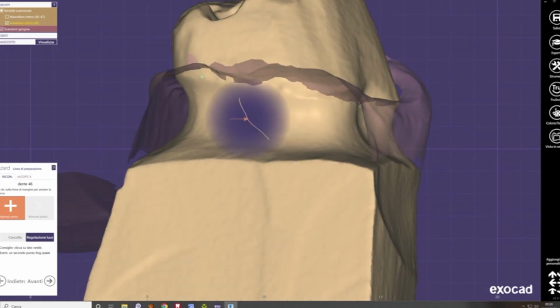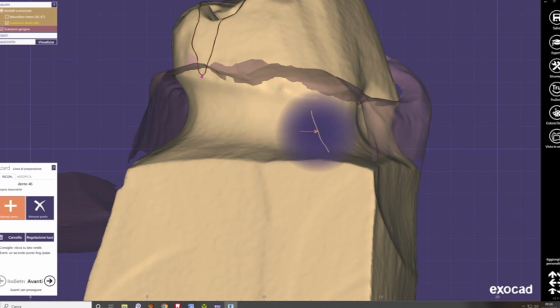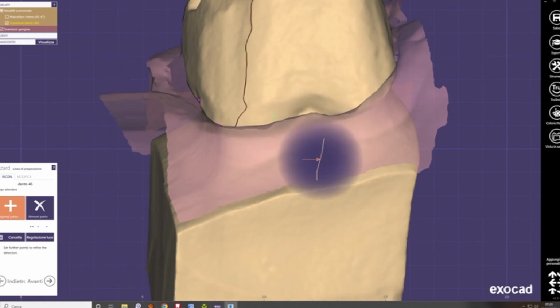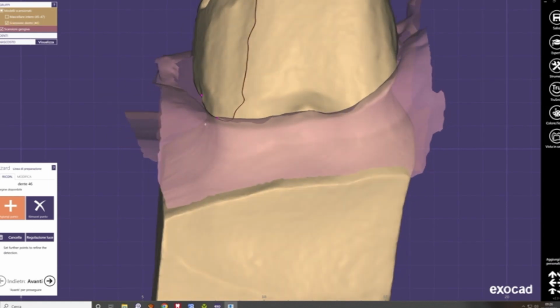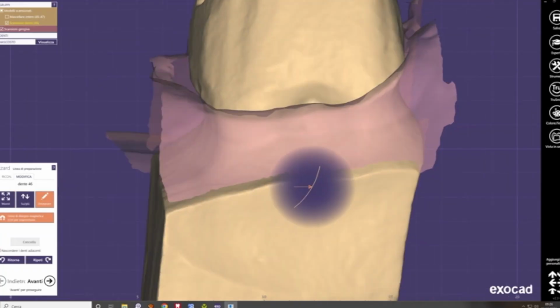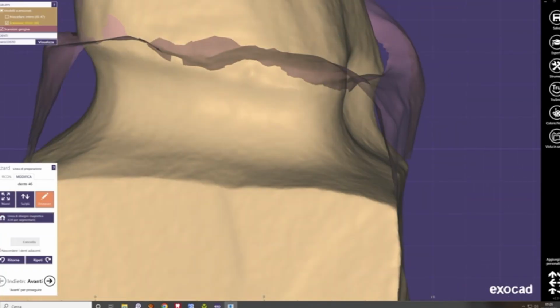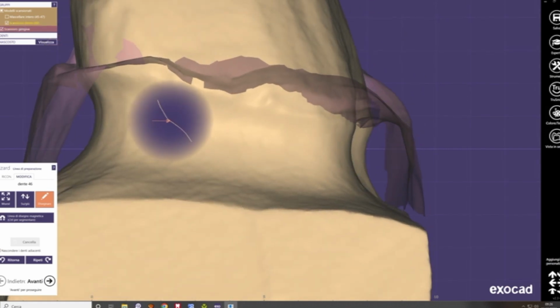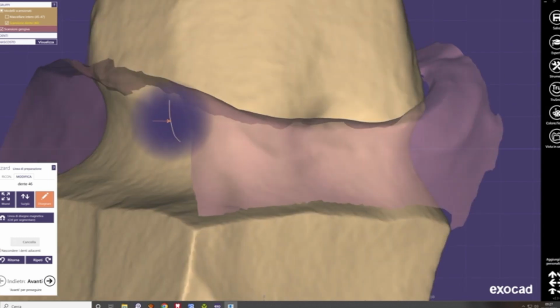The biggest mistake that happens with vertical preparations is always with the interproximal areas. Most of the problems when you have a problem of inflammation on soft tissues is because the interproximal margin of the crown is too deep. Especially in the areas where the tissues are more important, like in the anteriors. Where soft tissues are more flat, like in the posterior, it happens slightly less. But in anterior areas, this is very frequent as a mistake.